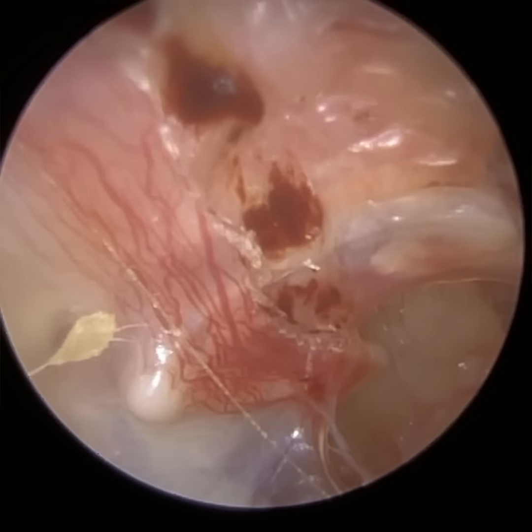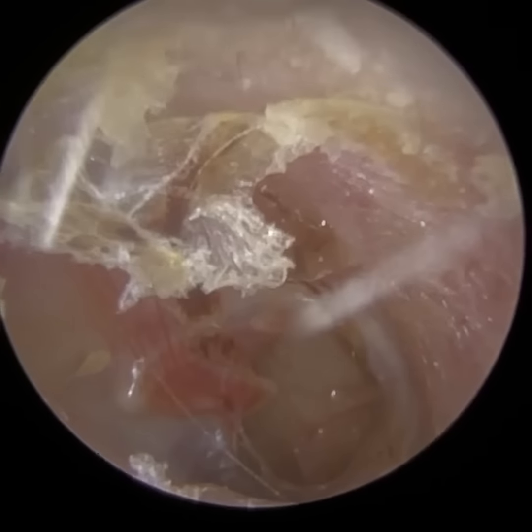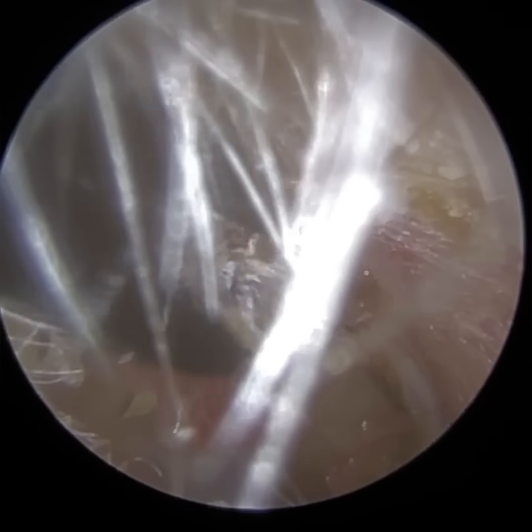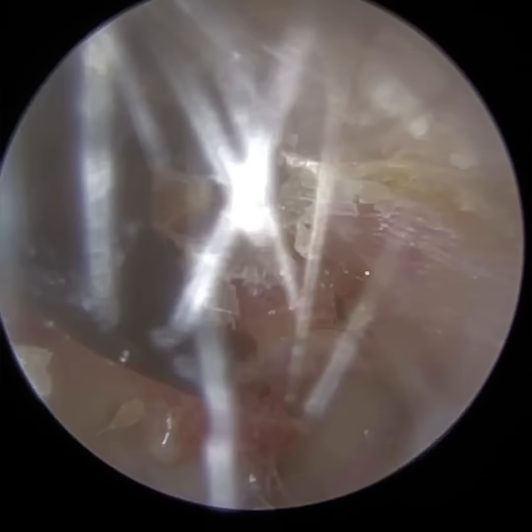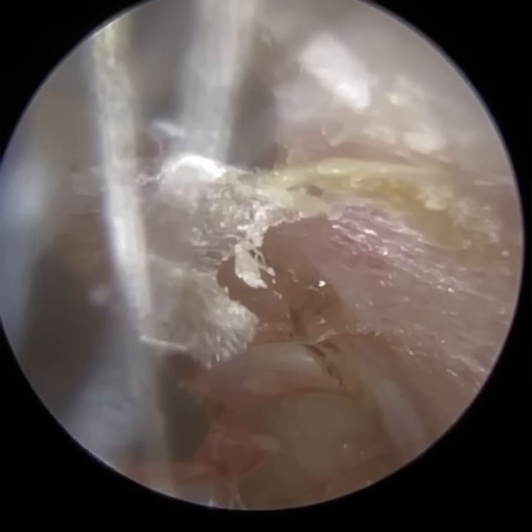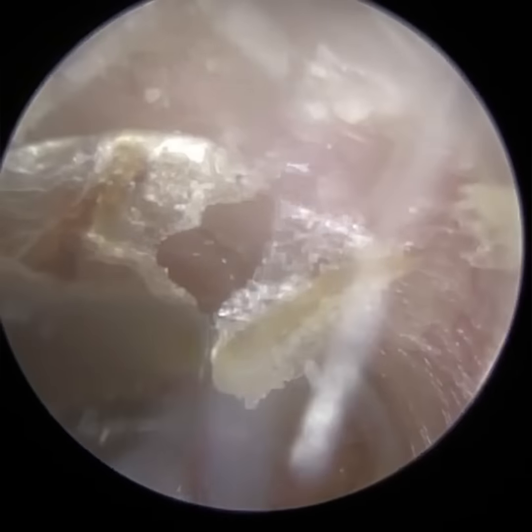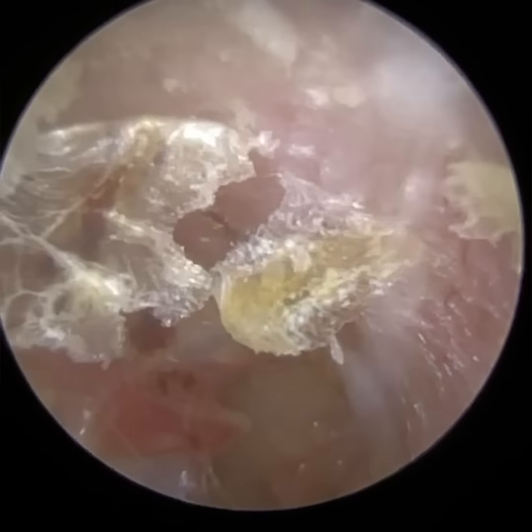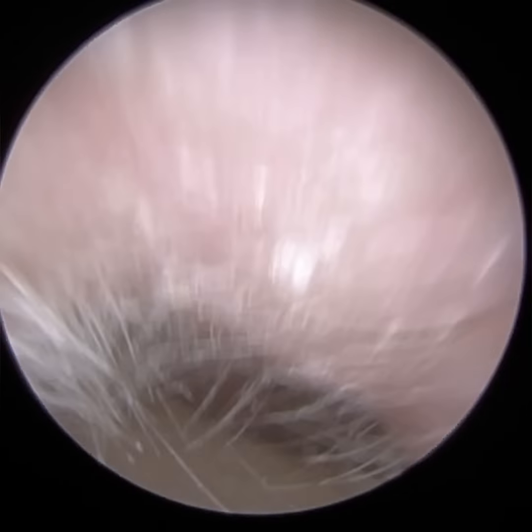You may see on the right hand side, so I said posterior perforation, but we call that a subtotal perforation. A subtotal perforation is when the hole encompasses 3 quadrants of the eardrum, which it has. So if you divide the eardrum in quarters, if the perforation invades 3 quarters, which it probably has there, but it's not towards the rim.